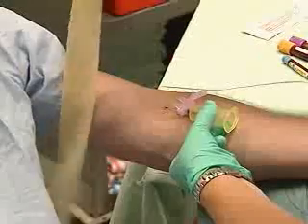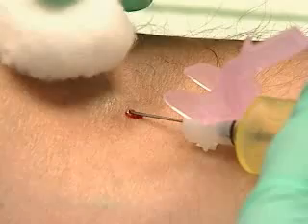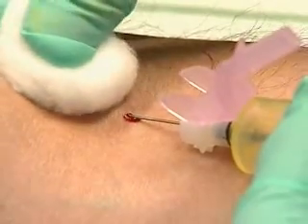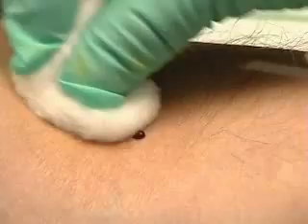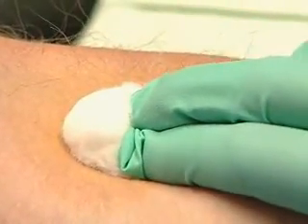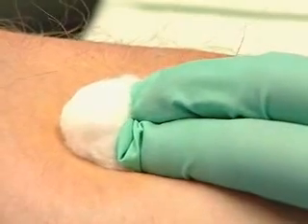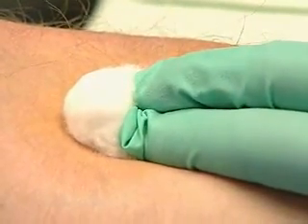As we finish, one pull of the tourniquet. Place the cotton ball above the puncture site, not directly on the needle. Withdraw the needle straight back and roll the cotton gently over the puncture, applying steady pressure. Having the patient bend at the elbow to hold the cotton in place can create unnecessary bruising.